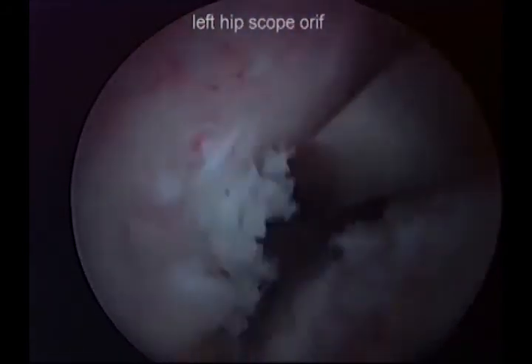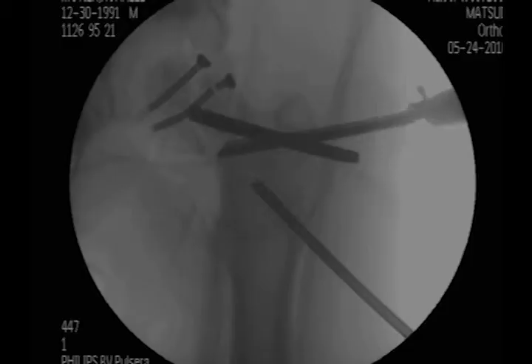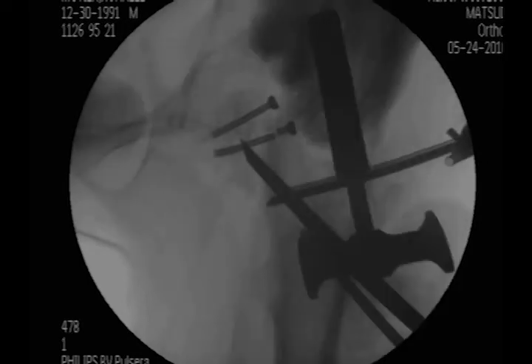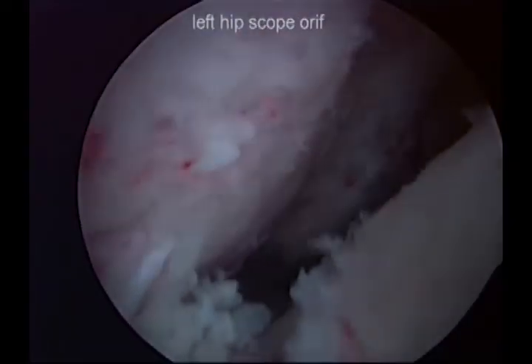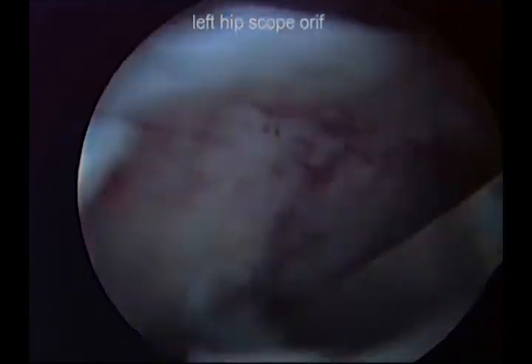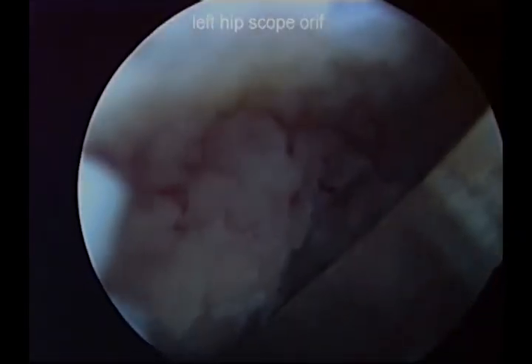Once we had performed this sufficiently, we then reduced the fragment in an indirect manner using the previously bent screw to provide reduction of the fragment and distribution of mallet forces over a larger area.